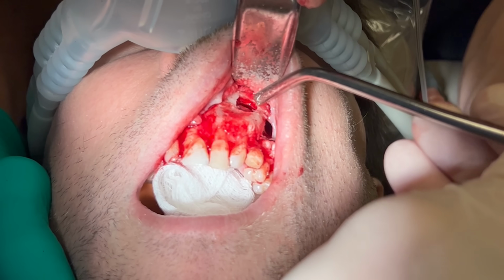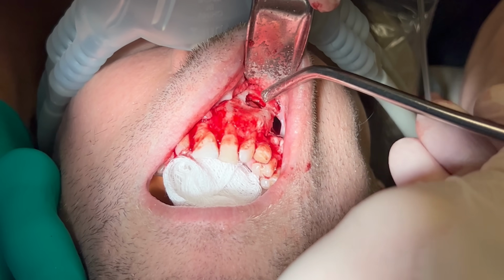Now I need access to this lesion, but I don't have it through the extraction socket. I make a bony window and locate the lining of this lesion.